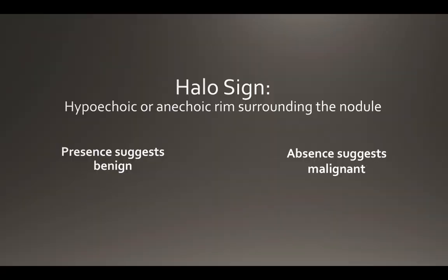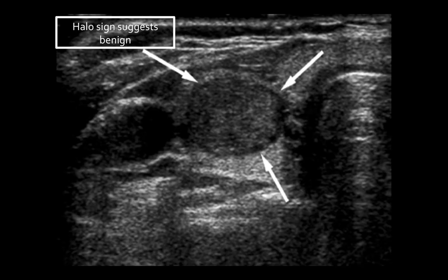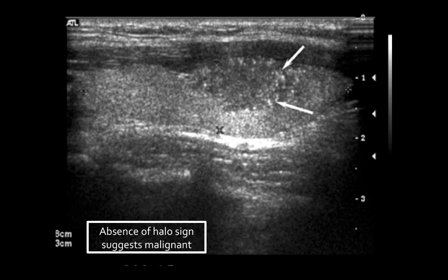The halo sign refers to a hypoechoic or anechoic rim surrounding a nodule. Its presence is often characteristic of benign nodules, whereas its absence can be concerning for malignancy. Here a nodule lies in the right lobe just medial to the carotid, and we can clearly see a hypoechoic rim completely surrounding the nodule — suggestive of a benign lesion. On the other hand, here we have a nodule that is hypoechoic, has punctate lesions, and there is no halo sign — this is very concerning for a malignant nodule.